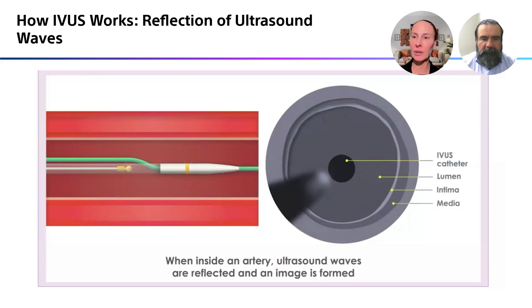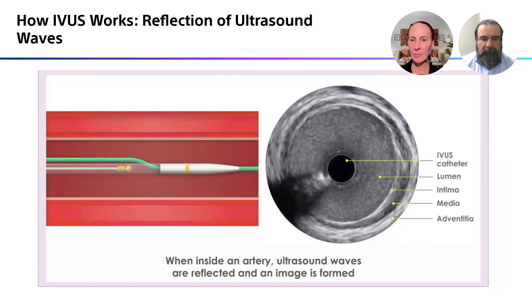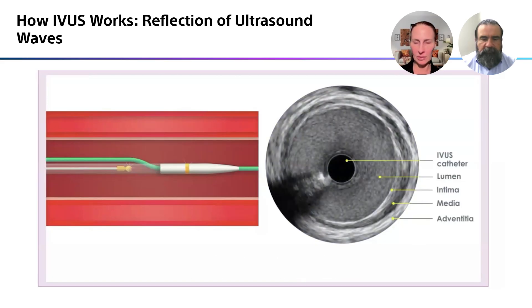What you can see here: the dark circle in the middle is the IVUS catheter. You see the lumen, the intima, the media, and the adventitia. And this is what it looks like in real life.